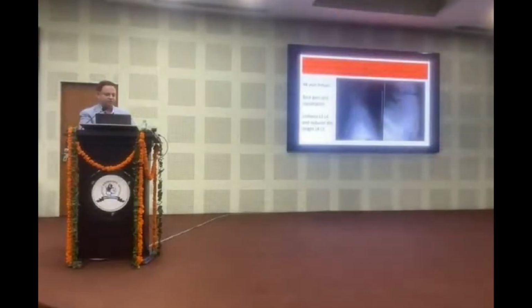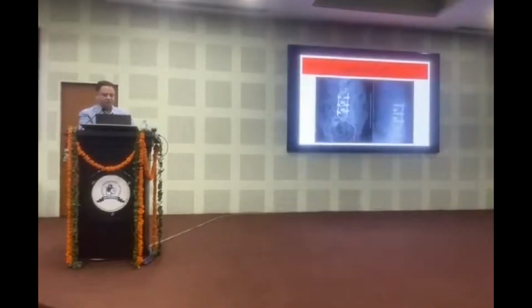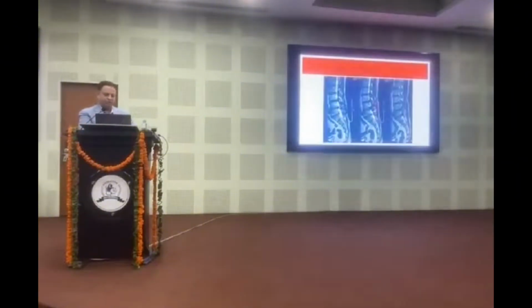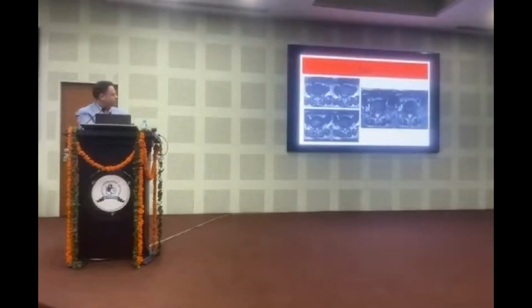The 48-year-old female, this is at 3-4, reduced disc height at 4-5. It's a 2-level cage, another one under local anesthesia. The 45-year-old male, back pain, bilateral radiculopathy. This is at 3-4, reduced disc height at 4-5 as well. This is a 3-level cage, and everybody would agree that all 3 levels require some sort of being addressed. And this is the MRI, and all 3 levels, you can see the stenosis there.